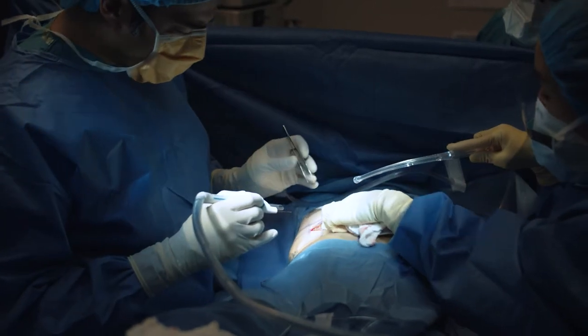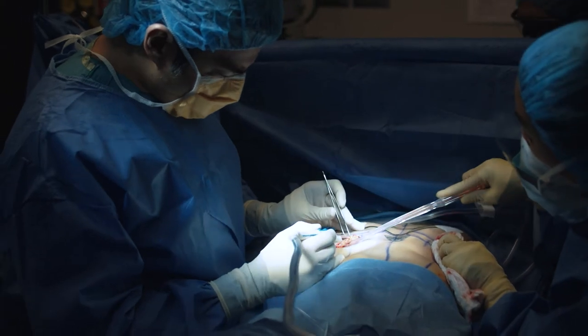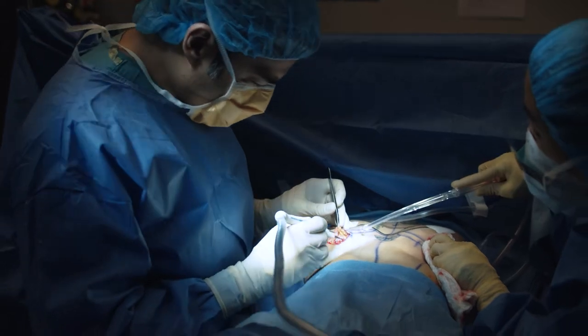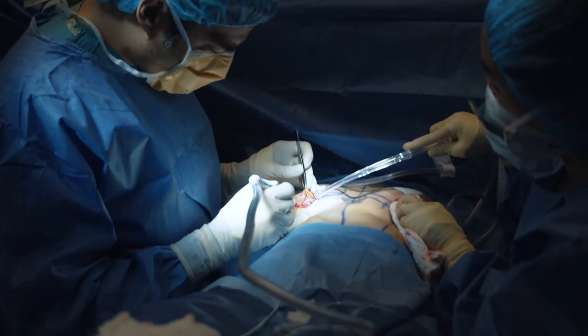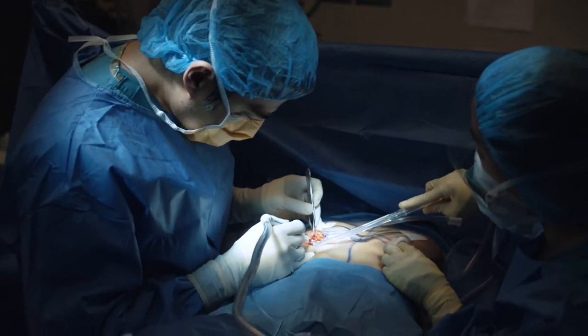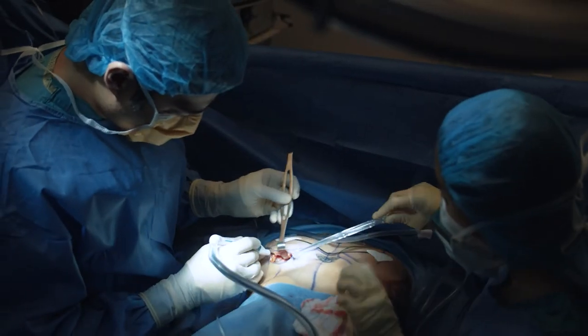Right now what I'm doing is dissecting through. We went through the skin. This is fat, this is breast gland, now we're going through the breast capsule, and we're looking for the muscle, the pectoralis major muscle. I'm using a monopolar cautery for my dissection. This is called an Army Navy.